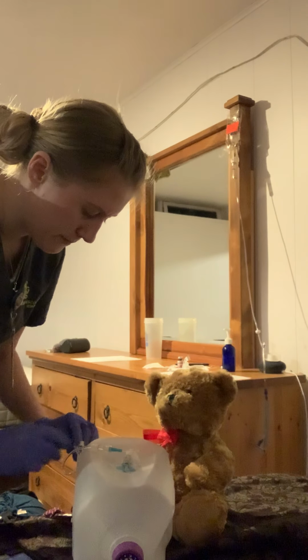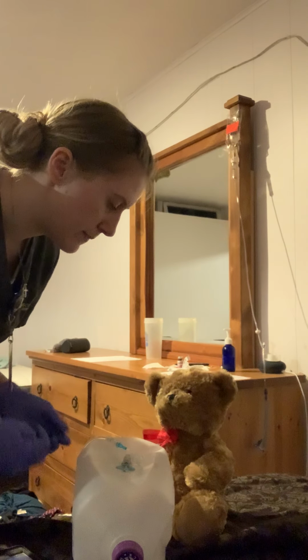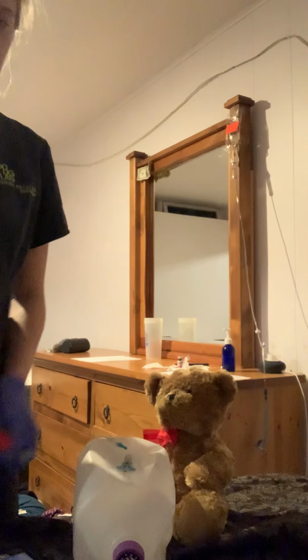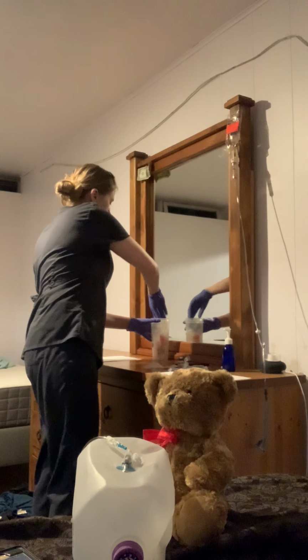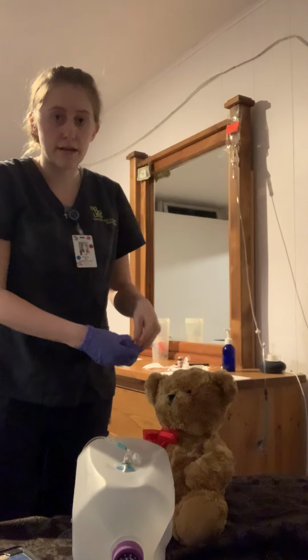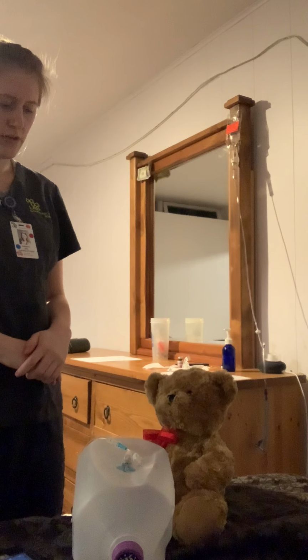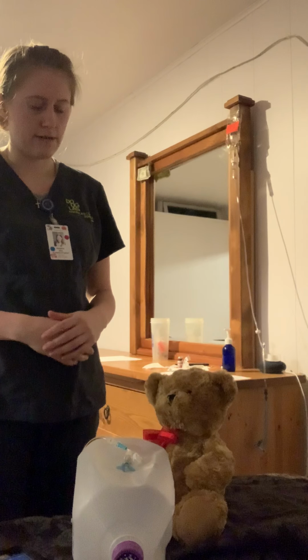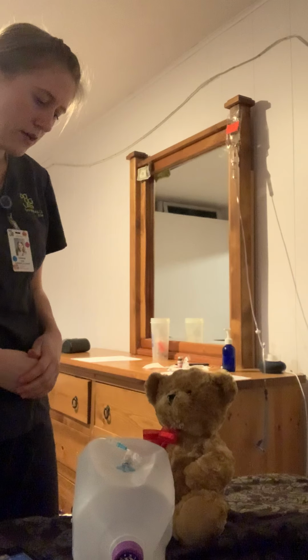Okay, and unclamp this. Again, just assessing the IV site, asking the patient how they're feeling. I'd stay with the patient to see if they have any side effects. I'd dispose of my syringes in a box here. I'm going to take off my gloves, dispose of them, hand hygiene. Again, just staying with my patient, seeing if there's any side effects like I mentioned earlier, any hypotension, dizziness, or any other adverse reactions to the medication.